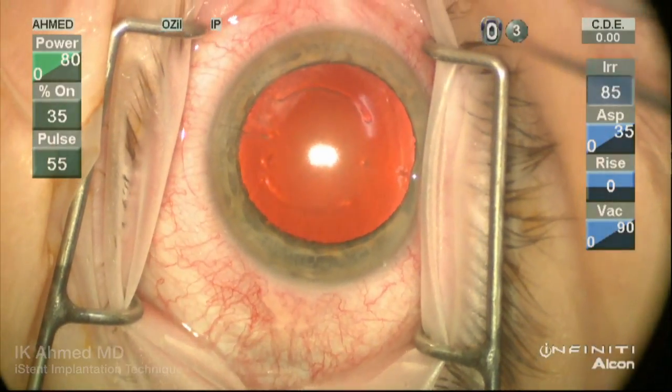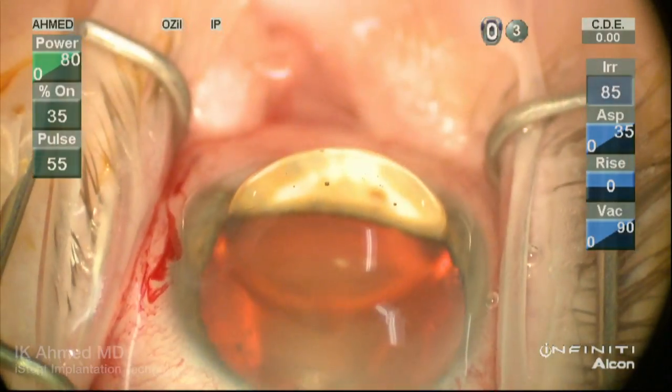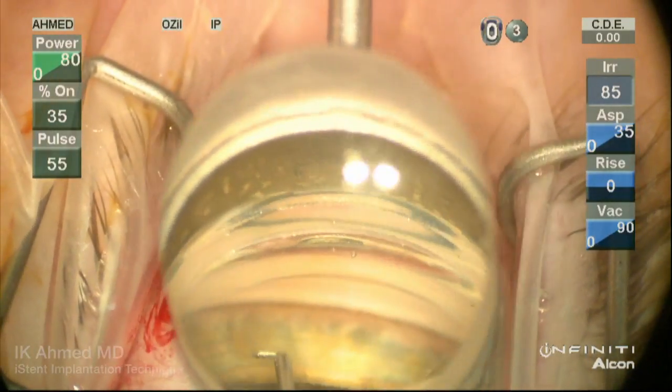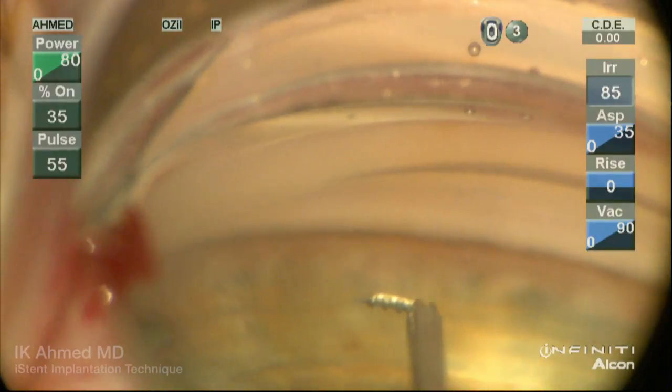Note the distribution of the episcleral vessels around the limbus. In this case, we're implanting the iStent prior to phacoemulsification. The head has been turned and microscope tilted, and we have a Swan-Jacob lens to visualize the nasal angle.